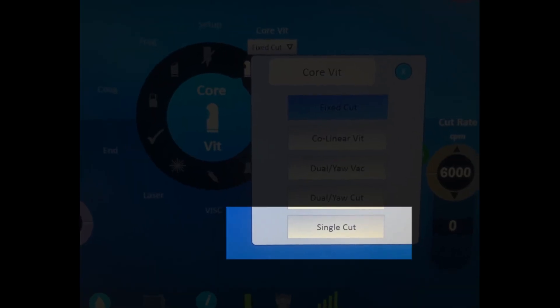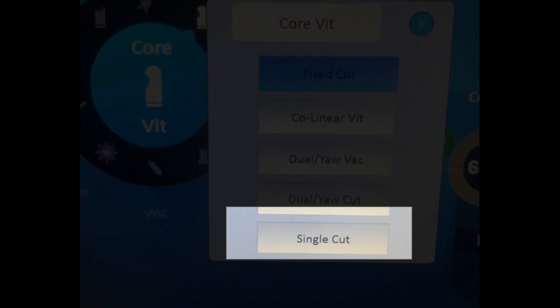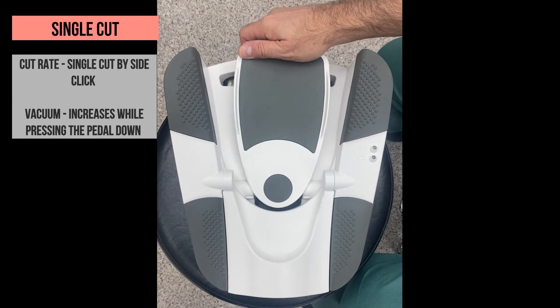The last sub-mode is single cut. This sub-mode works like scissors. While pressing the pedal down, the vacuum gradually increases, and one side click makes a single cut.